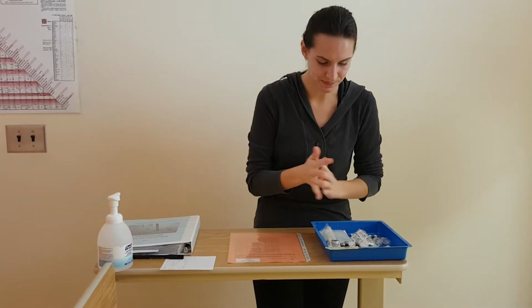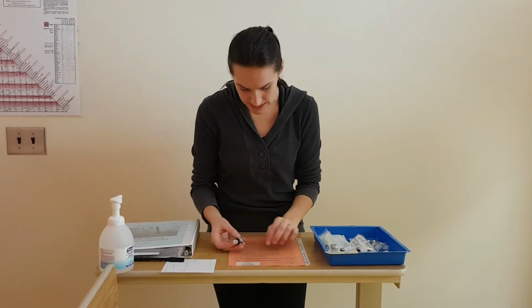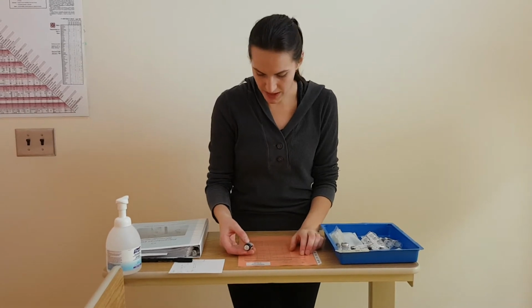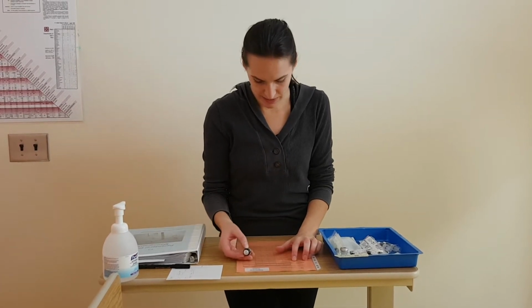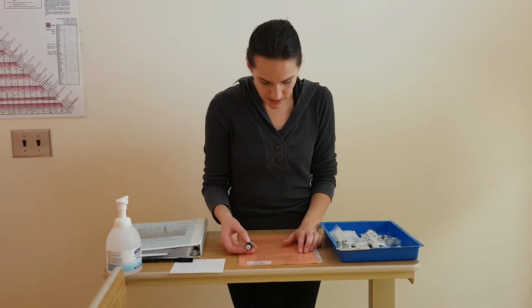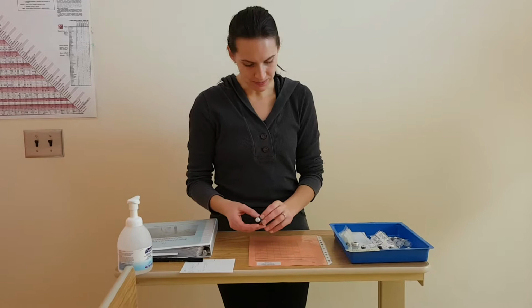So I'm going to just begin by performing my first medication check by comparing the MAR to the medication vial. So I have the correct patient, Emma Wrightson. They have an allergy to morphine. The correct medication, Lasix or furosemide. I have 40 milligrams, which I can get accurately from this vial, IV, and it's given once at this time, which is right now.